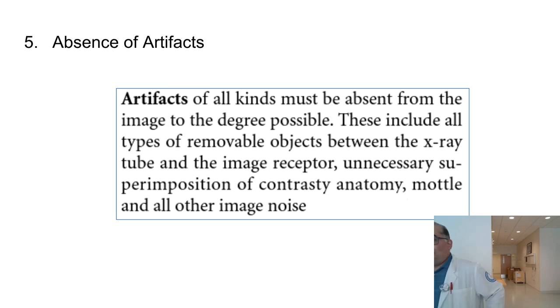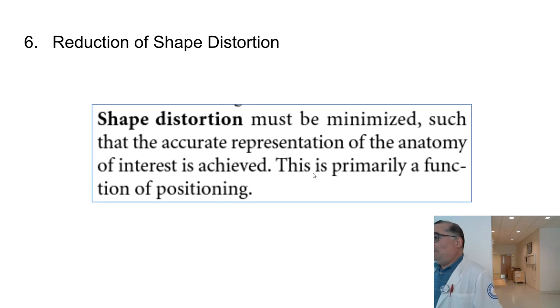Right. Don't want those in. What about a cochlear implant? Yeah, that's okay. It can't come out. Maybe a microphone part, but the part that's built in, that's been surgically placed into the patient, you can't do anything.